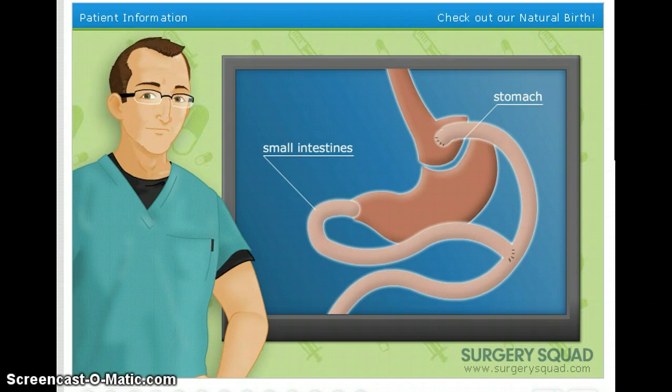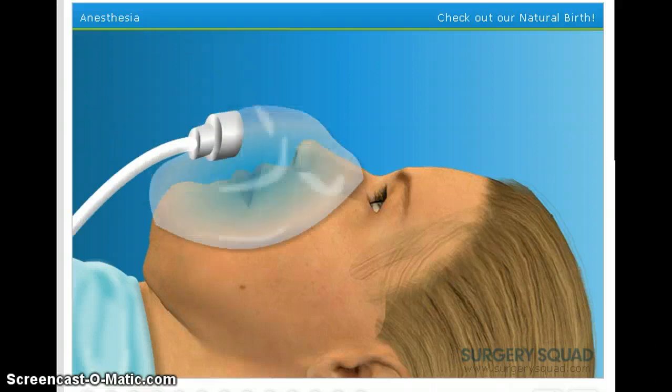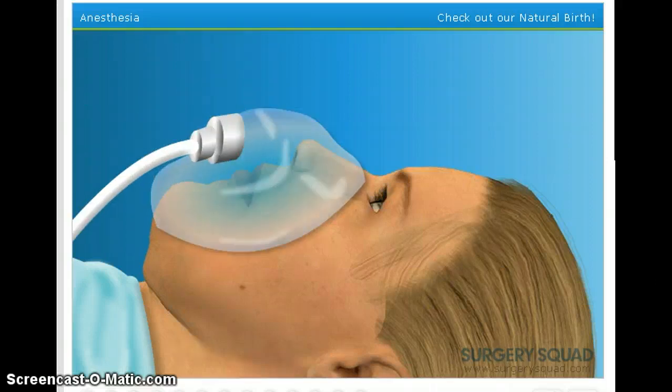The procedure will usually take 2 hours to perform, but with skills like mine and the magic of the internet, I bet we can whip this stomach into shape in about 5 minutes. 5 minutes? Alrighty. Our patient has been prepared for the procedure with a mild sedative, and now the anesthesiologist places a mask over her nose and mouth, and she'll drift off into dreamland.